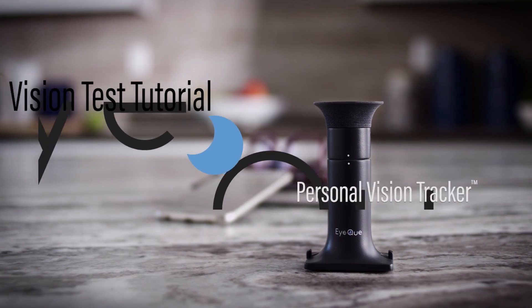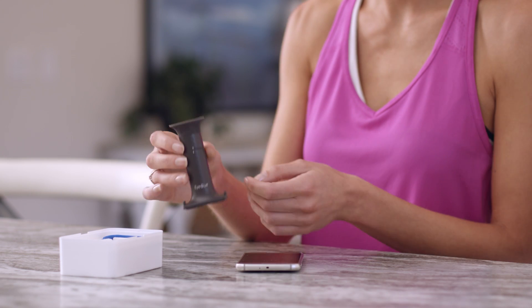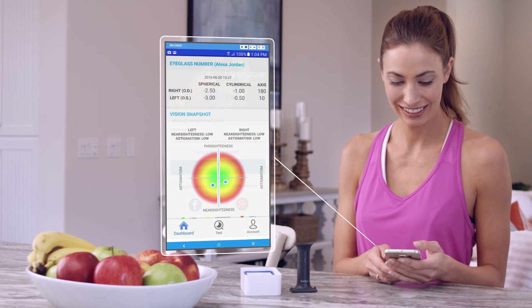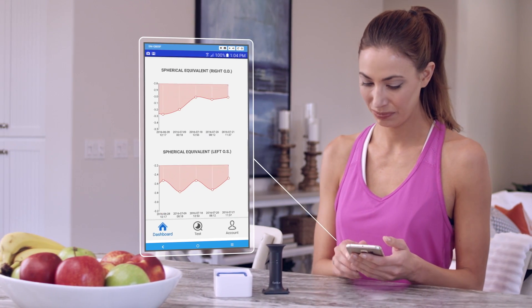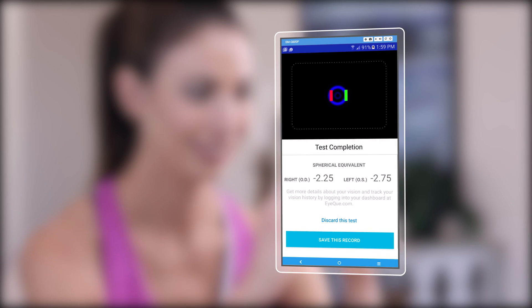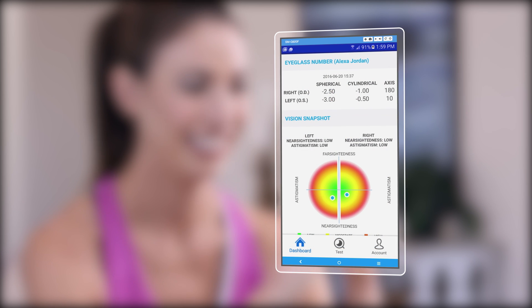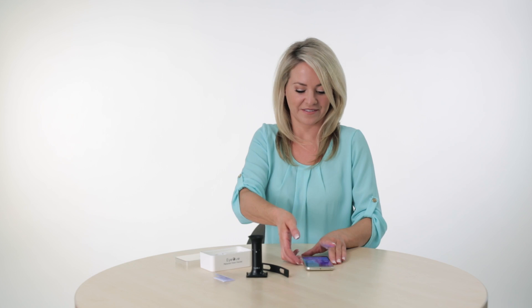Welcome to the EyeQue Personal Vision Tracker Vision Test Tutorial. Over the next several minutes, we'll show you how easy and fun it is to use your mini-scope to start testing your vision and generating accurate vision records. While we try to make the experience as easy as possible, the EyeQue Vision Test is based on a number of scientific measurements, and giving your full attention to the steps and suggestions in this tutorial will lead to faster and better results. Let's get started.